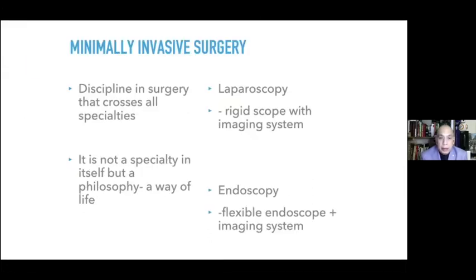With minimally invasive surgery, we all know that this is a discipline in surgery that crosses all specialties, from general surgery down to pediatric surgery, thoracic and cardiovascular surgery. To us, it is not a specialty in itself, but a philosophy, a way of life for us surgeons. Minimally invasive surgery can be more or less divided into two: laparoscopic surgery, as you have seen with the two lecturers previous to me, and endoscopy. The one uses a rigid scope, and the other uses a flexible endoscope and an imaging system.